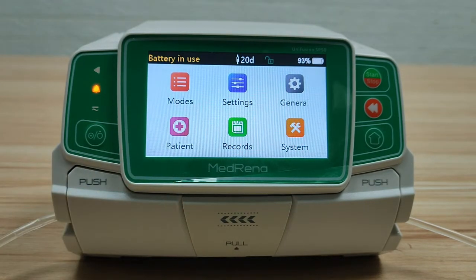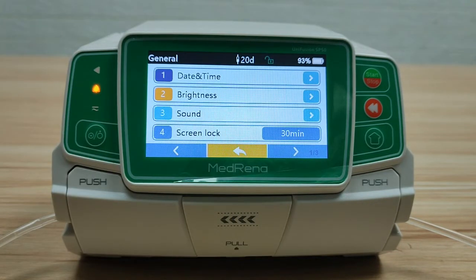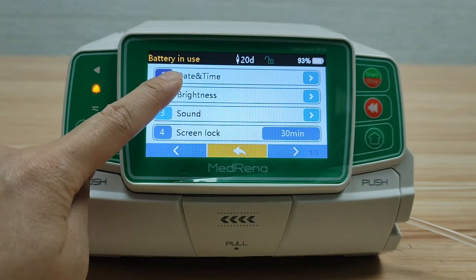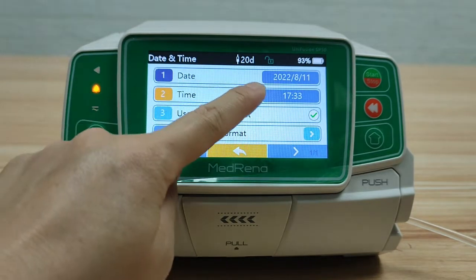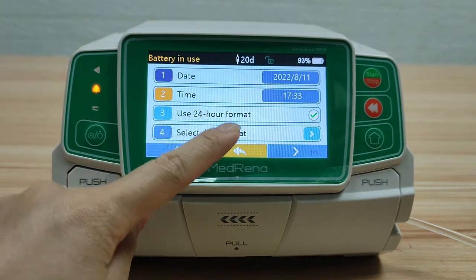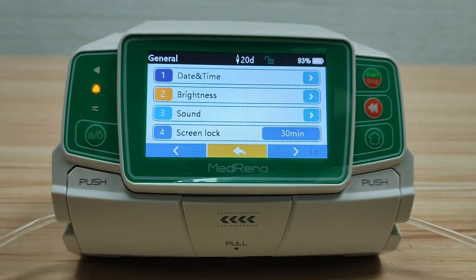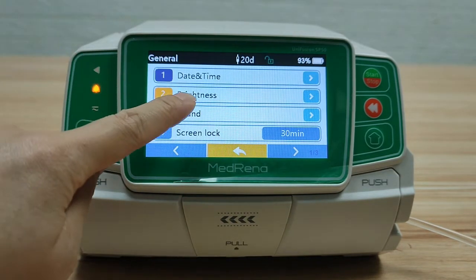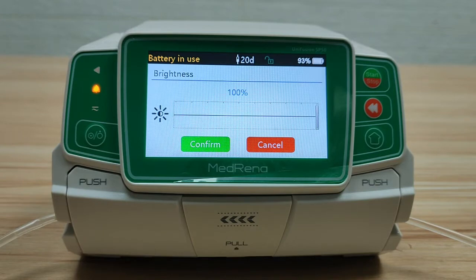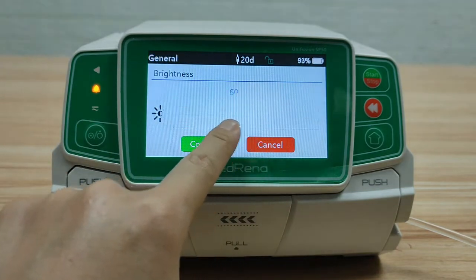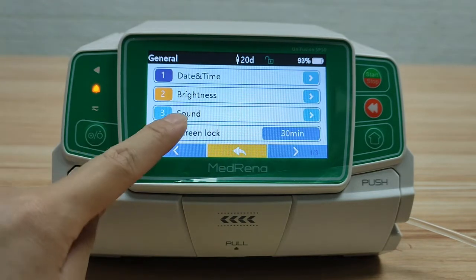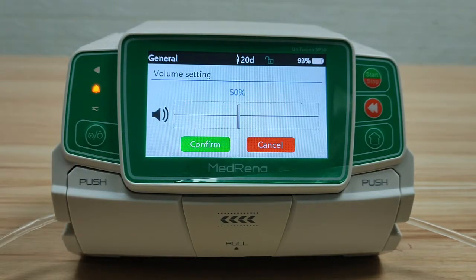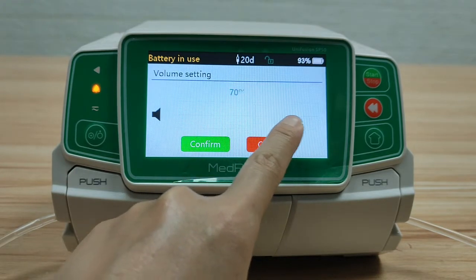Next, let's look at General. The first item is date and time — set the correct date and time and your preferred format here. Second is brightness — there are 10 brightness levels for choosing. Sound: there are also 10 levels of sound volume for choosing.